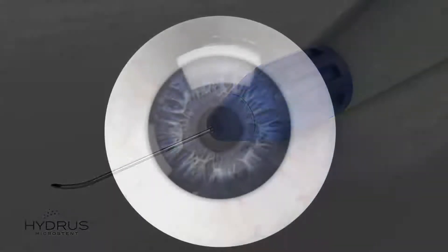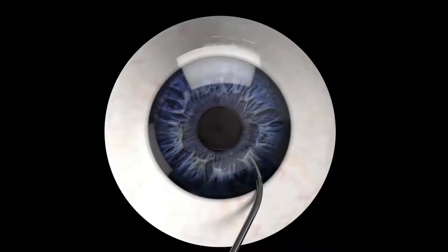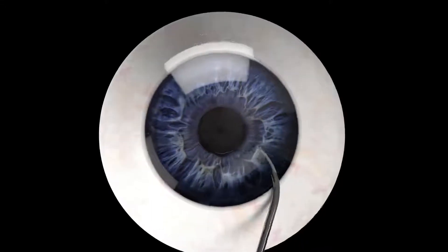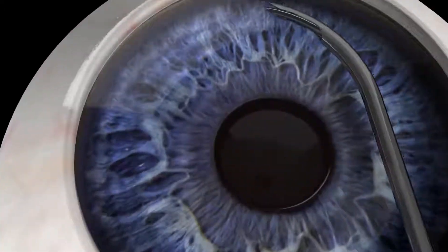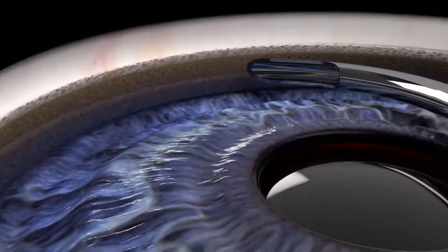The Hydrus cannula is inserted through a corneal incision at the temporal position and directed towards the trabecular meshwork, where it is positioned parallel to Schlem's canal.